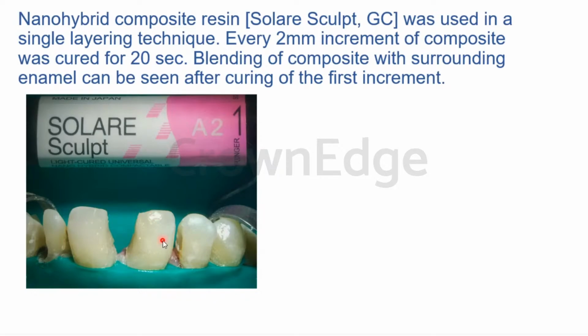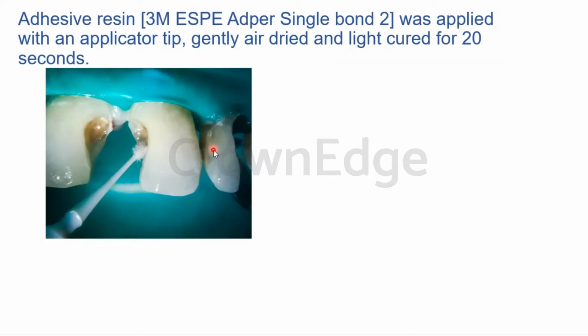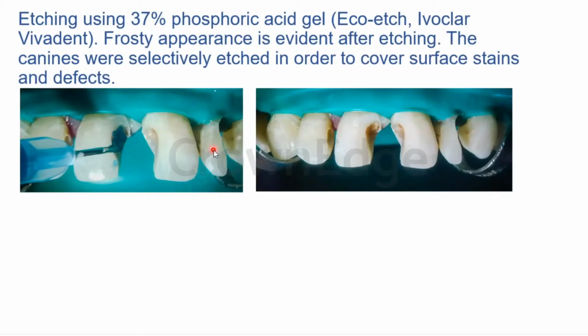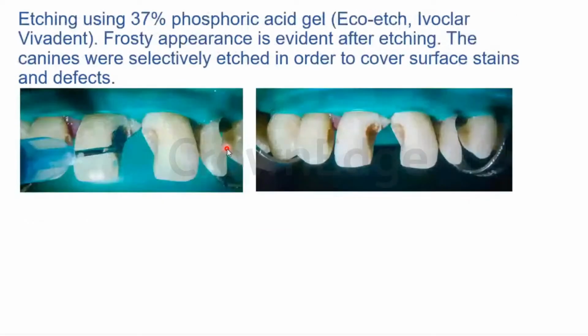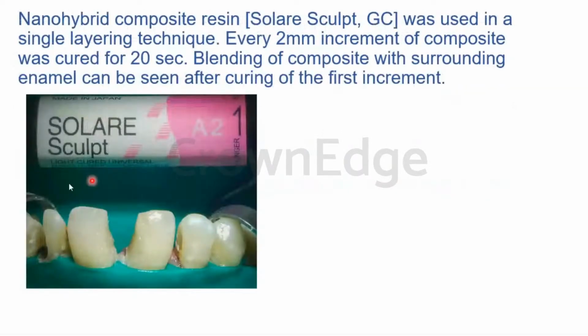You can create a mock-up, which means that with the preoperative evaluation that you have, or even the first scenario that we had, you take an impression, send it over to the lab, and ask for a mock-up. So they basically add some wax over these areas, right? They can add some wax over these areas, and they will send it back to you, preferably white wax, so that they can carve it well. You take a repeat impression of that, and then you place it as a palatal wall, right?